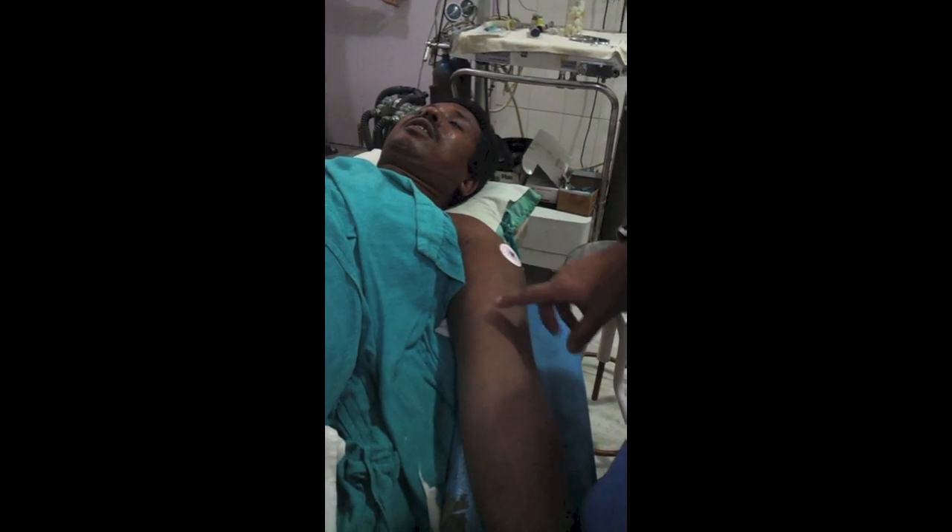This limb is now anesthetized. You can go for surgery anytime. This is the block assessment at exactly 40 minutes.